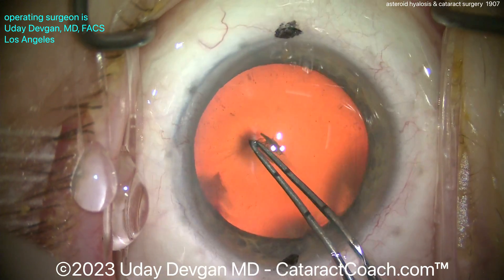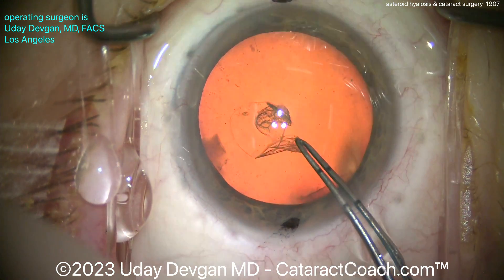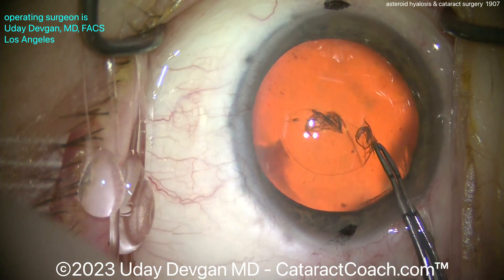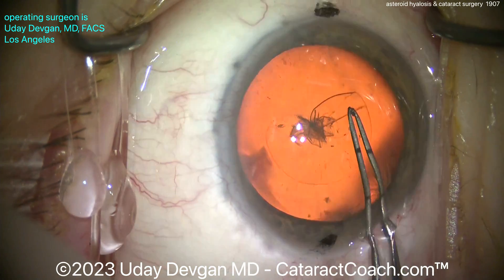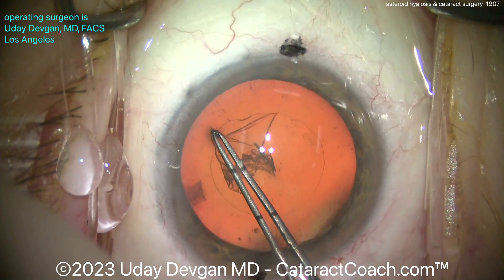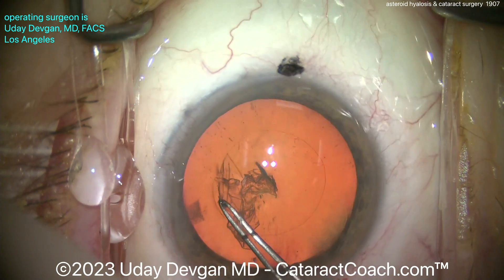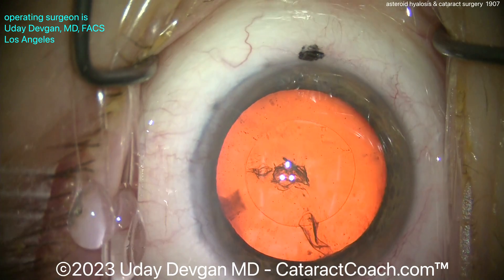Let's start this case — an otherwise normal routine cataract. We'll get our 5-millimeter capsulorhexis done. As the eye moves a little bit, you can see the vitreous moving, and you can tell because those asteroid hyalosis bodies tend to be relatively fixed in the vitreous — they don't settle down with time. They appear to be adherent to that particular spot in the vitreous matrix. Here's a nice-looking 5-millimeter capsulorhexis.